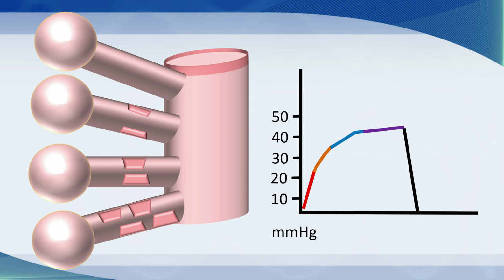Now, what I have here is a series of airways going from top to the bottom, and you can see the airway at the top. There's a nice clear passageway between the alveolus and the main airway. So those bronchioles are nice and clean, and so they'll empty really, really quickly when the patient starts to exhale. The second one from the top, you can see there's some constriction of the airway, but it's not that narrow, so those airways will empty fairly quickly as well.